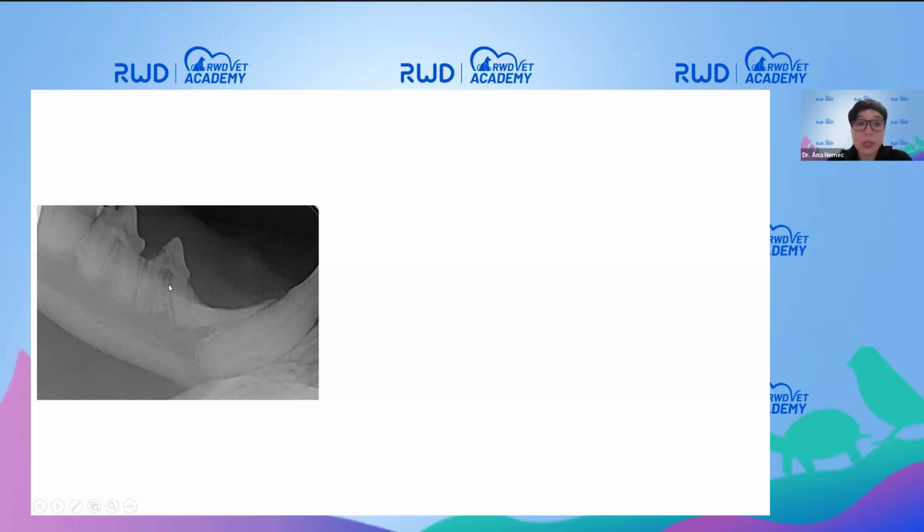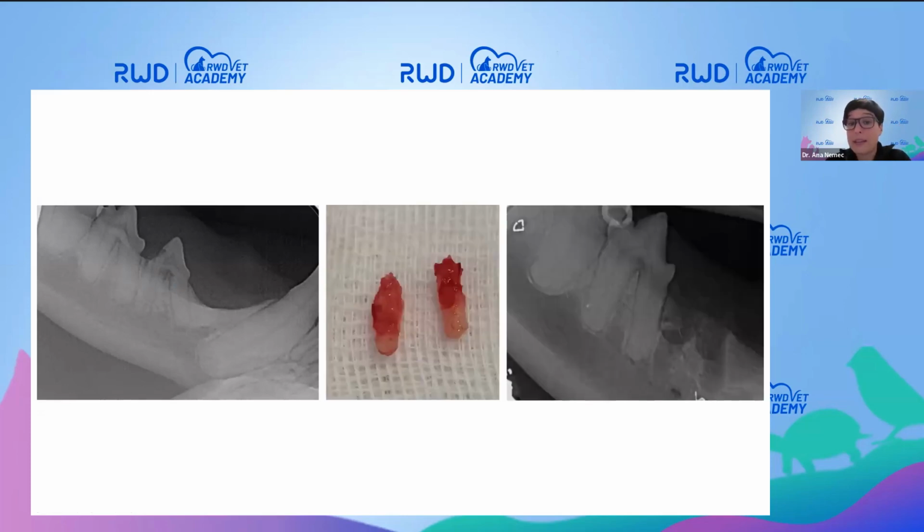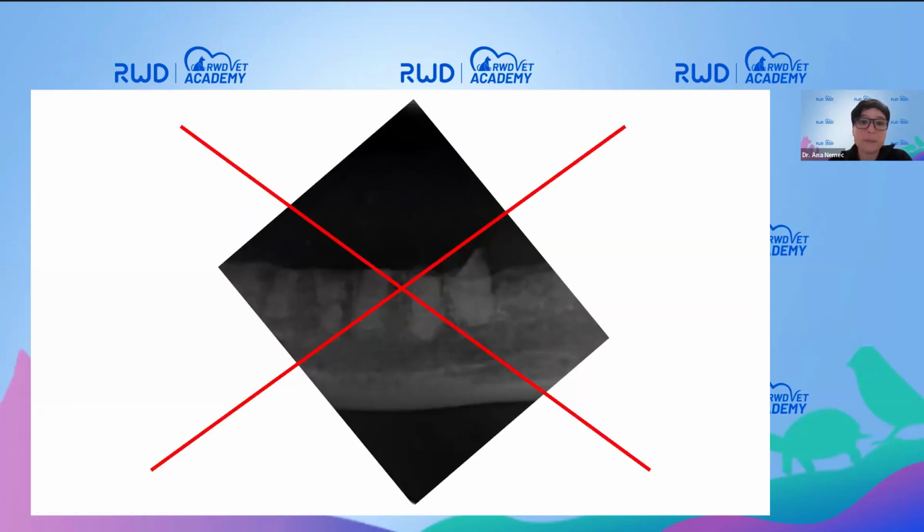We know already radiographically that we have to remove the mesial root. And with the distal, we actually look clinically to see if we can see the tooth there. Eventually, even the distal root, yes, was partially resorbed, but the apex, as you can also see radiographically, was intact. So this needs to come out. Then we confirm complete removal of the tooth also radiographically.